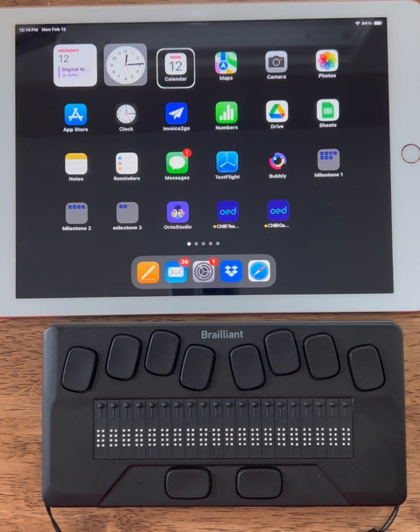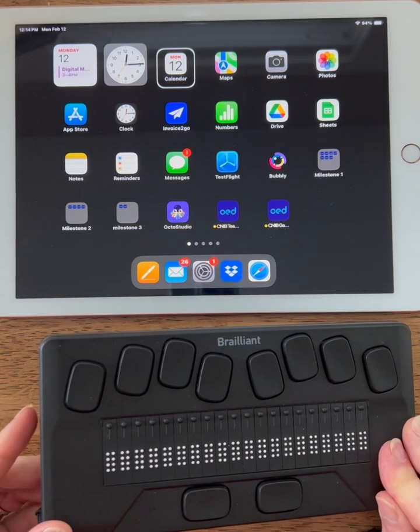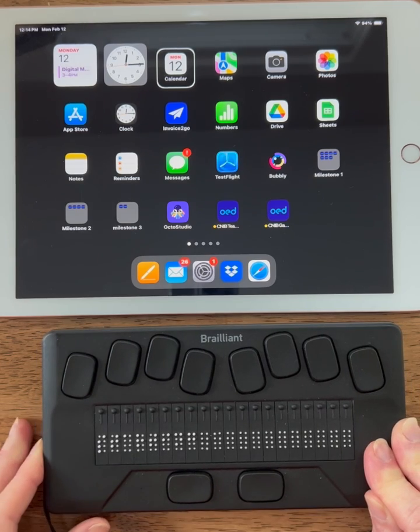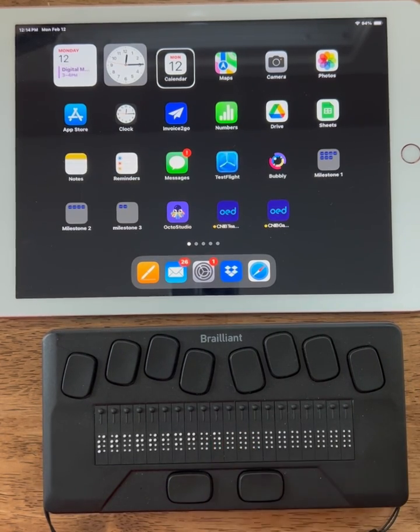Any time you start the Brailliant back up, you have to put it in iPad mode — that's what we're going to do. I'm going to start my Braille display back up by pressing the on button. What causes this is that the Brailliant BI 20X is a standalone note taker as well as a Braille display. So after the initial pairing between the Brailliant BI 20X and the iPad, each time I turn my Braille display back on, I must go through these steps to put the Brailliant in iPad mode before it will interact with the iPad.